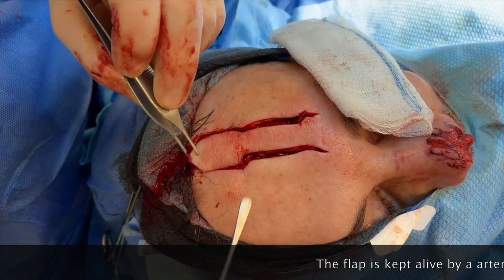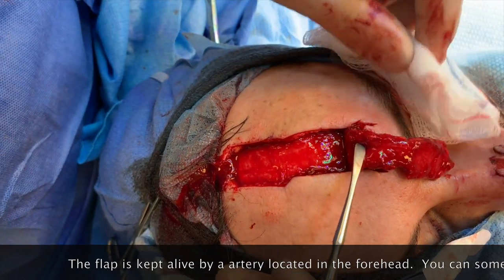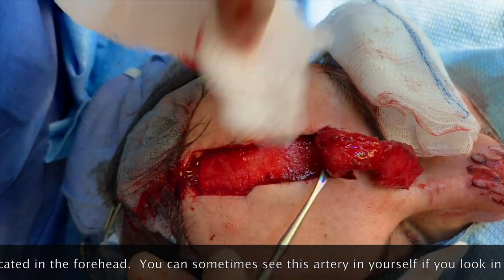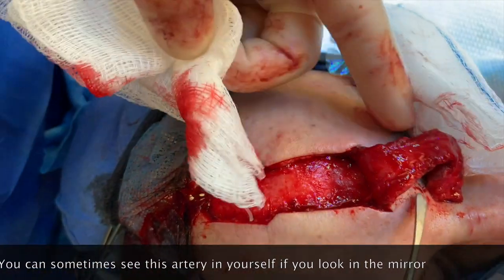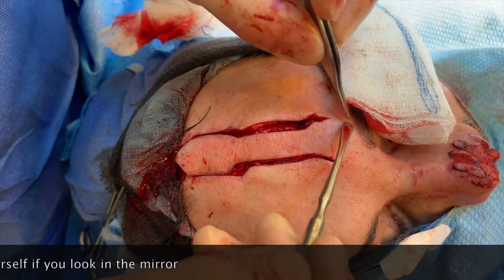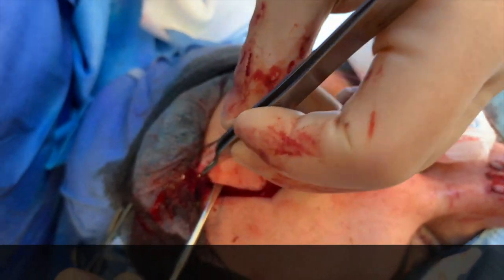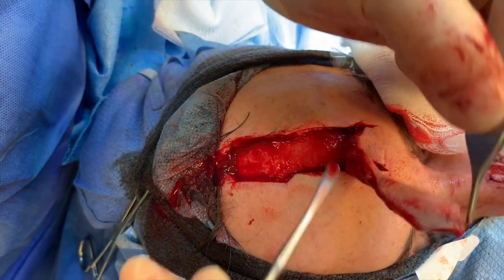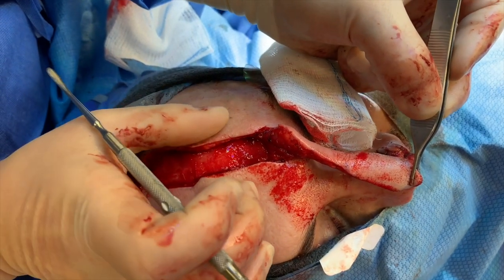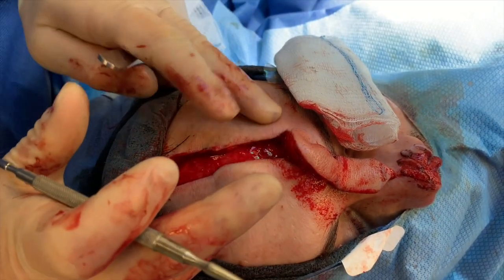We've elevated the flap and made these incisions. The flap is taken off the galea here and onto the periosteum down here, and it's attached to a blood vessel right there. We use the Doppler to find and identify that vessel. That vessel feeds this whole flap — you can see it's nice and pink, and it's bleeding at the end. This is going to rotate and provide coverage. We'll close this side to side, and we'll take another video at the end to show you what it looks like.